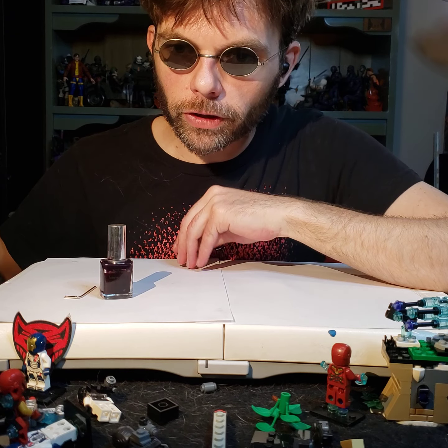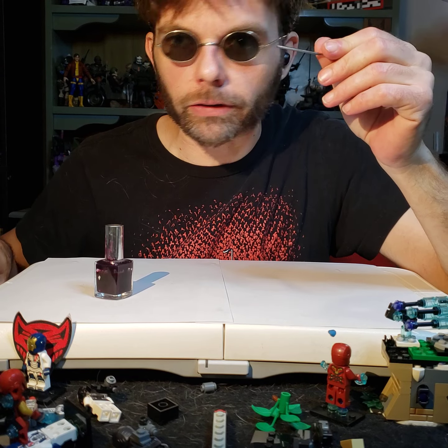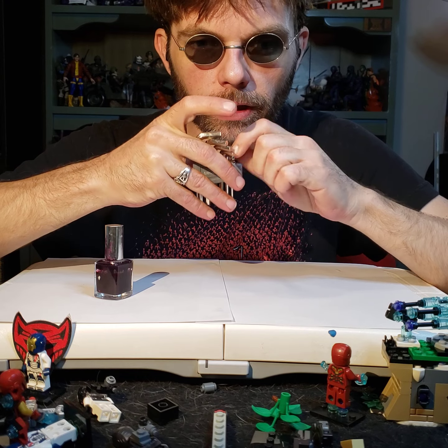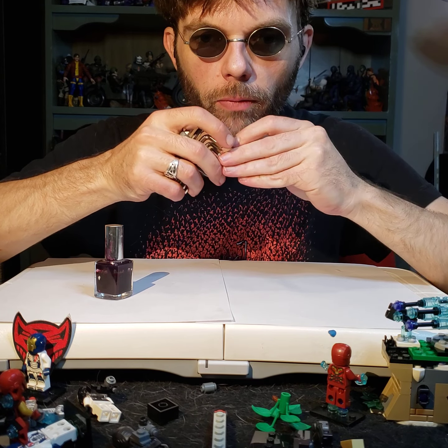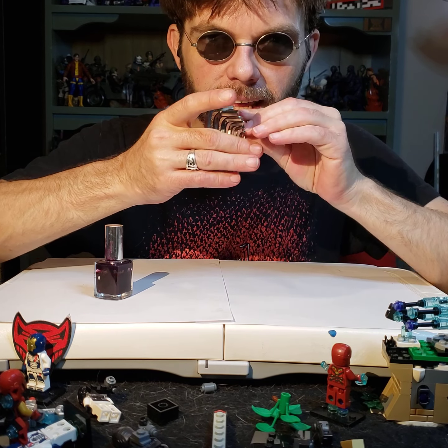So today I'm going to explain to you how, and you only need two tools. You're going to need the smallest possible Allen wrench. I've got my entire set of Allen wrenches right here, and the tiniest one at the very end is the one you need. Actually, no, wait, I'm sorry. It's the next to the smallest.